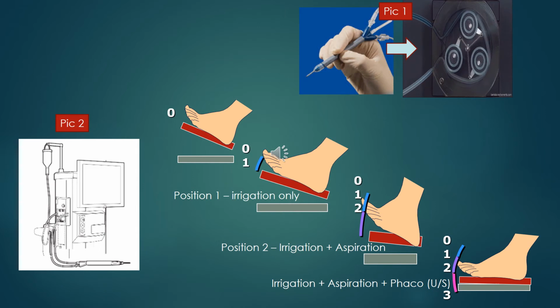And this is because of the gravity, because it is hanging and it has a gravity pressure. So as fluid moves out of the eye because of the pump rotating, we call it aspiration, it is also getting filled because the fluid now will come from the bottle. The eye is a closed chamber. So if you have the fluid going out of the eye, you will also have it replaced because it is attached to a bottle with the fluid.